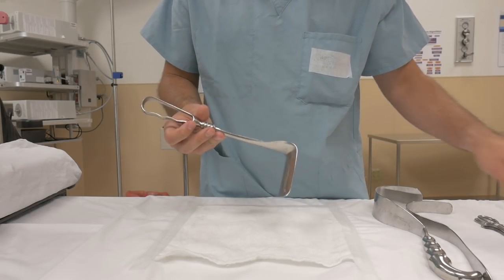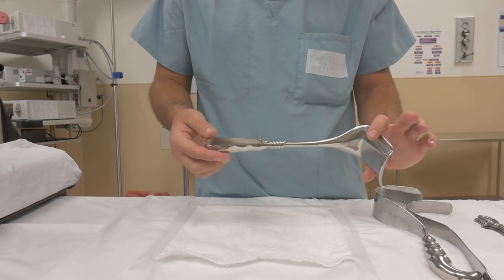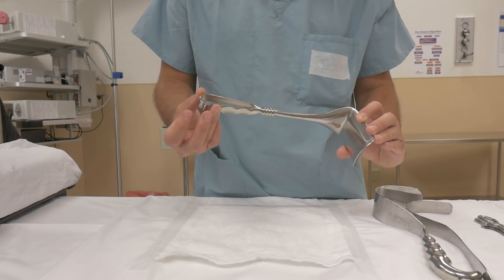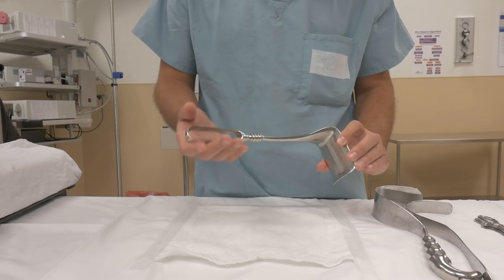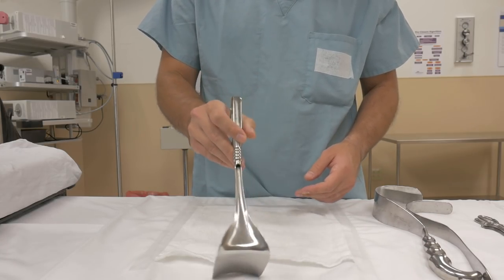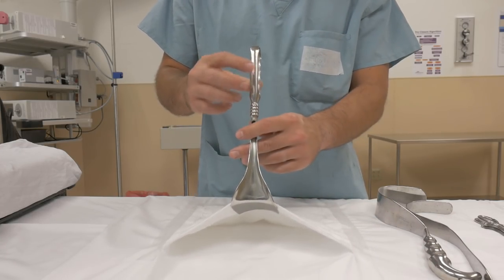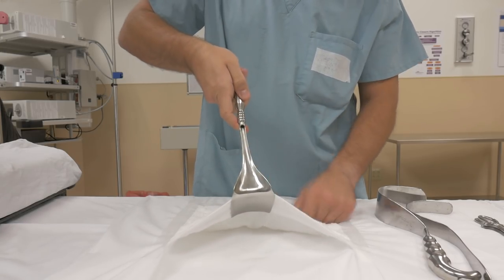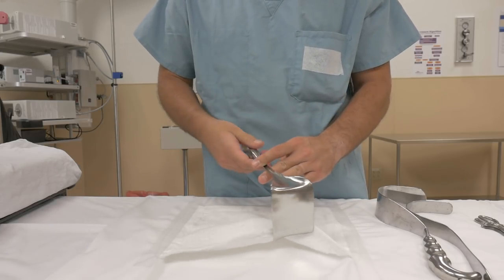Kelly retractors are very similar to the Deaver as far as the ergonomic grip — you get the finger grooves — it just doesn't have a hook at the end. You're placing it in place, you have a nice hole you can hold on to, grip it like this or like this, whatever feels comfortable.